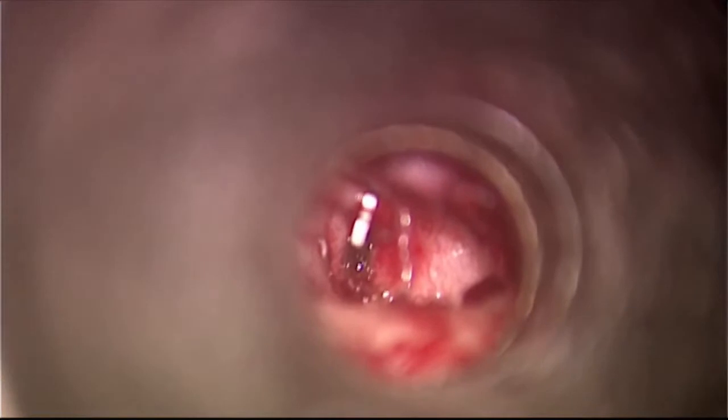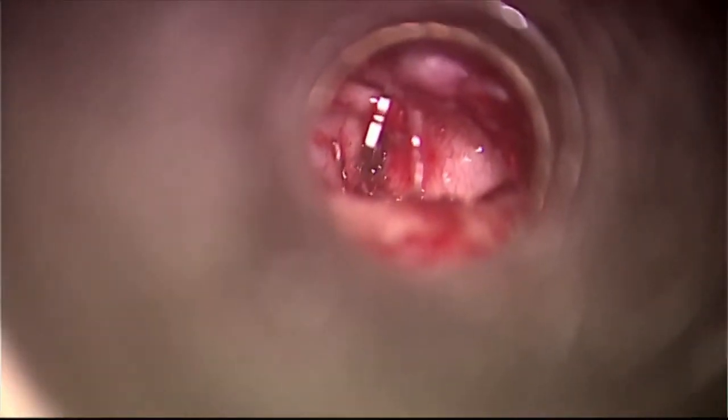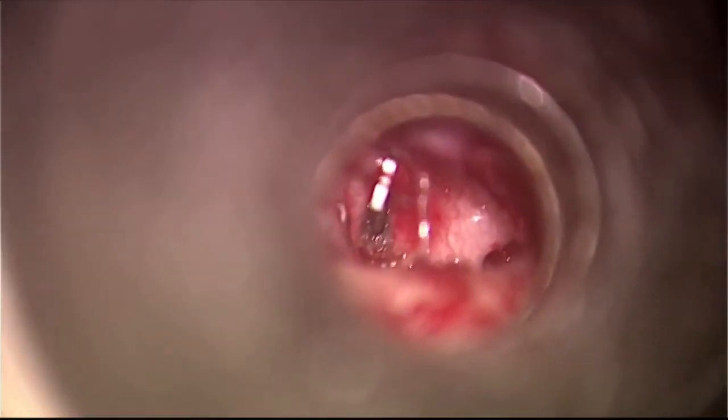And believe me, this laser and piston make a difference. This piston makes your life so easy. I told you several times. We cannot be Ashim. He uses two hands. I don't know how a human being can do that, two hands through this trans-canal opening to crimp the piston. That is not possible. That is really difficult. Boss, you can do it if you want.